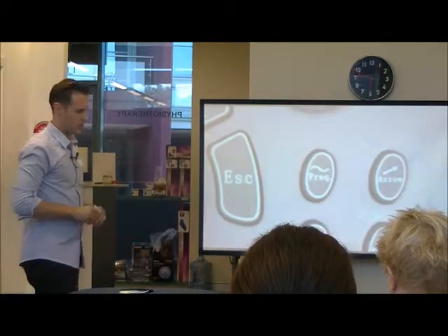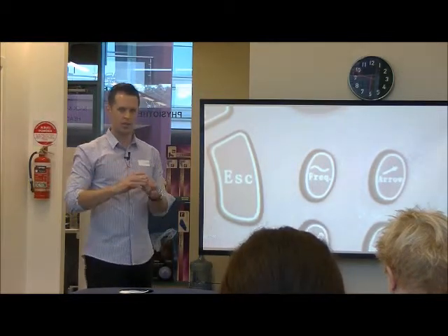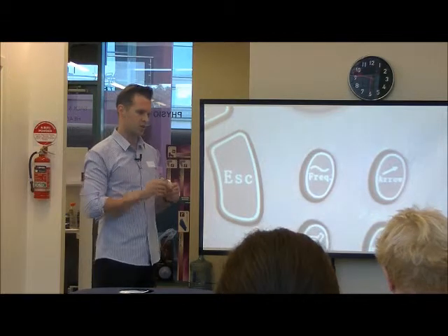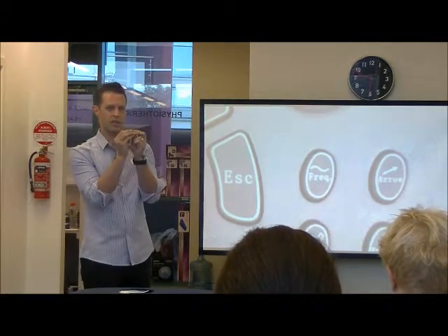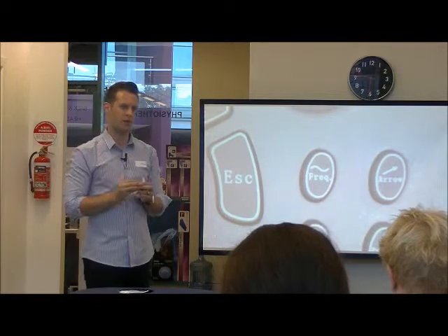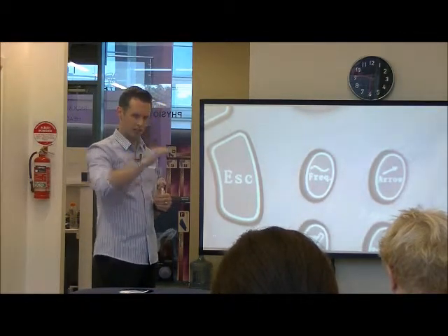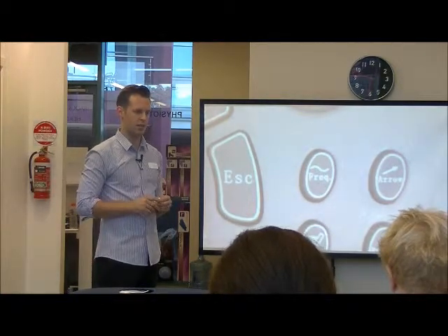In terms of frequency, with ultrasound, the higher the frequency, the clearer or more defined the image. So the higher the frequency, the greater the ability to see two very small points which are close together and to differentiate between them. However, when you increase the frequency like that, you lose more in terms of power. So the higher the frequency, better definition, but the weaker the ultrasound. So it's not going to be able to penetrate as deeply.